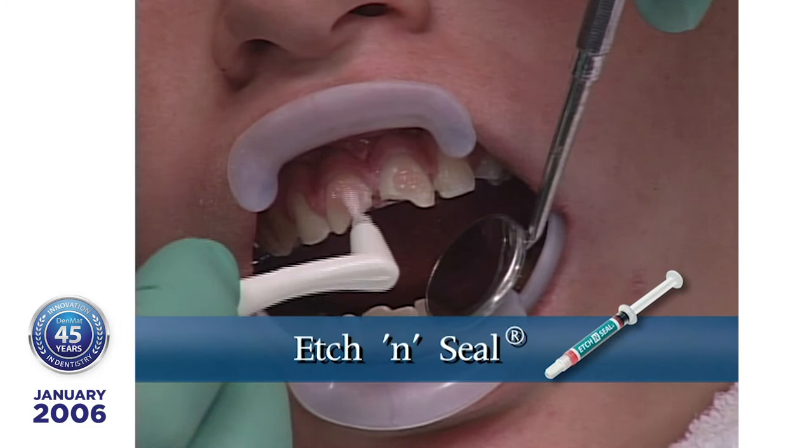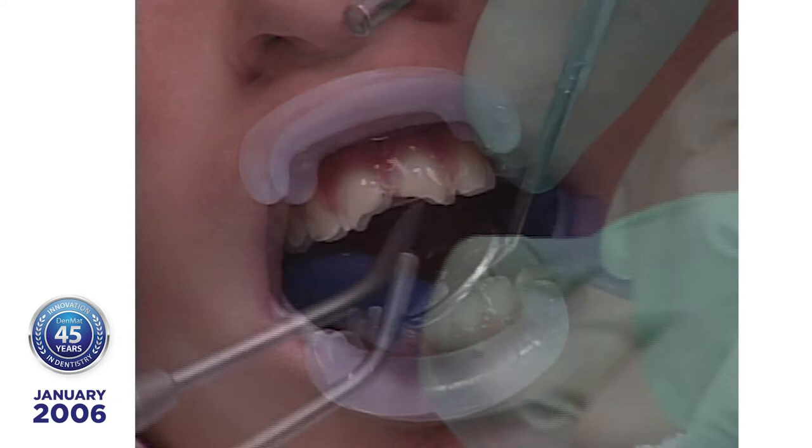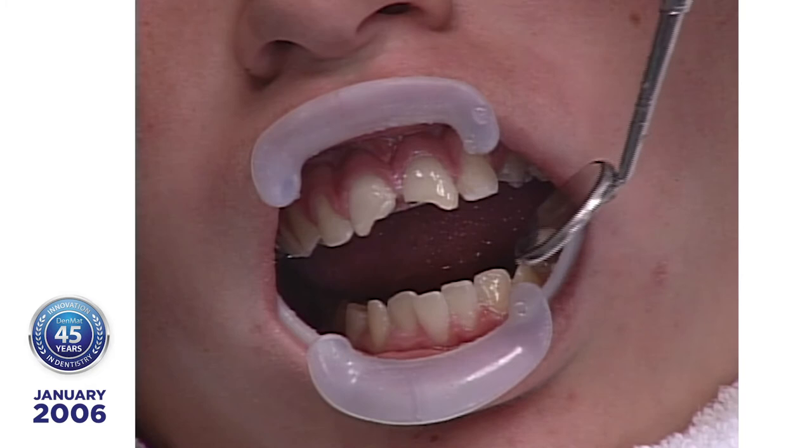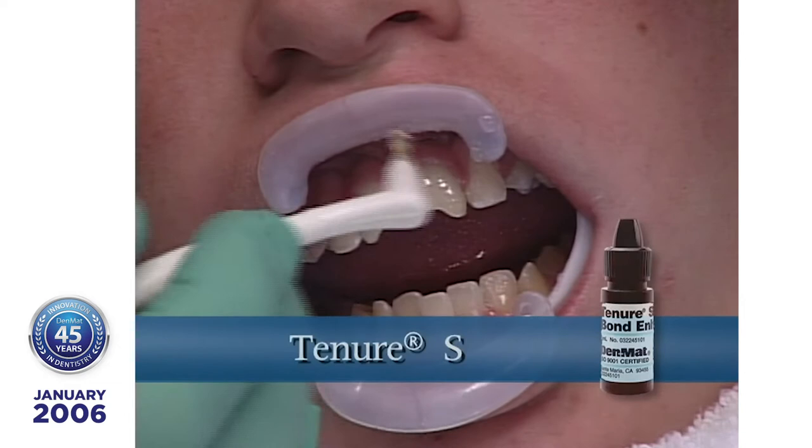Paint each tooth with Tenure A and B, a self-cured adhesive bonding agent. After a few seconds, a shiny appearance on the tooth surface should be seen. Apply a layer of Tenure S unfilled resin to the teeth to protect against moisture contamination. Remember, do not light cure until the lumineers have been placed on the teeth.